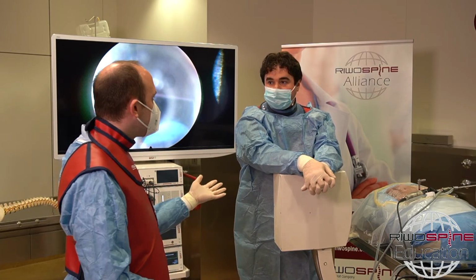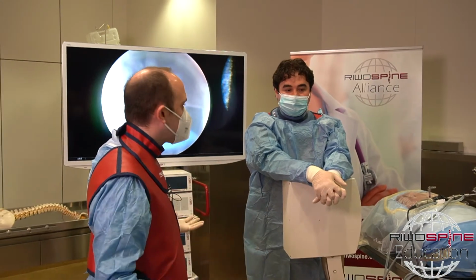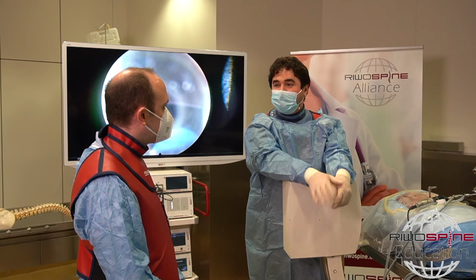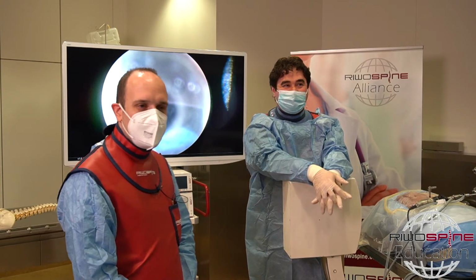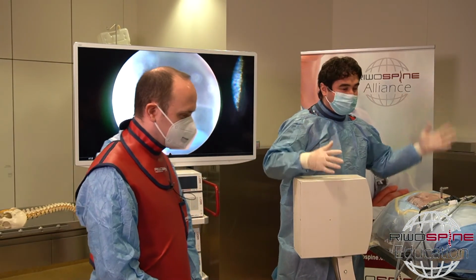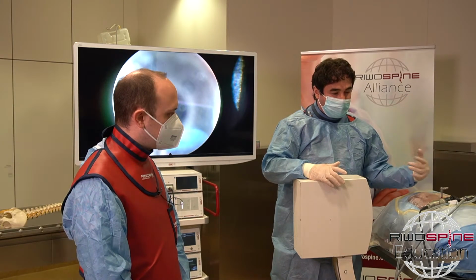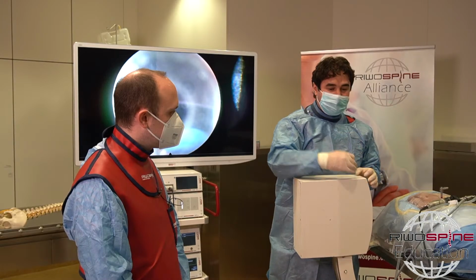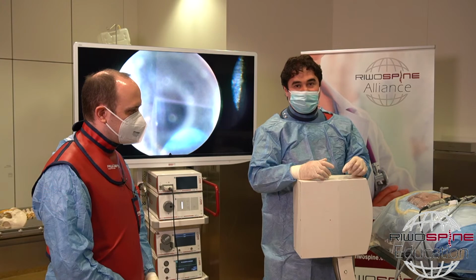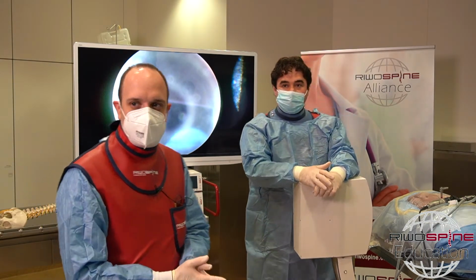So if I get you right, it means also that the surgery time for a thin patient and a thick patient are exactly the same, yeah? Because there is no difference, yeah. Only the positioning of the patient may be a little bit difficult for the fat patients, but it's not a problem. What we do, the same steps. We just mark the interlaminar window under the AP control, and we do the incision, and then directly we go with the dilator, even with 5 centimeters of fat tissue or 10 centimeters of fat tissue, it doesn't matter. I hope that we could answer the questions that were given.